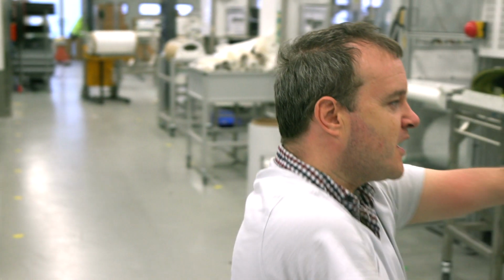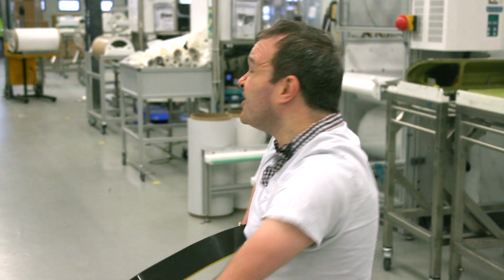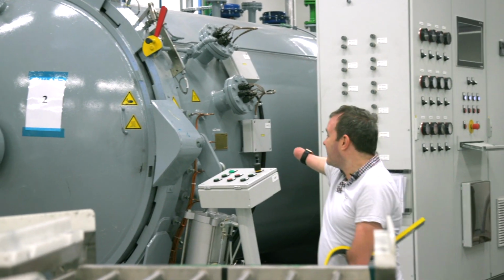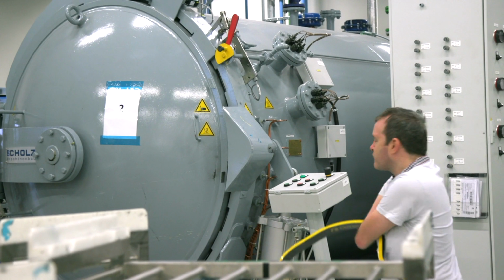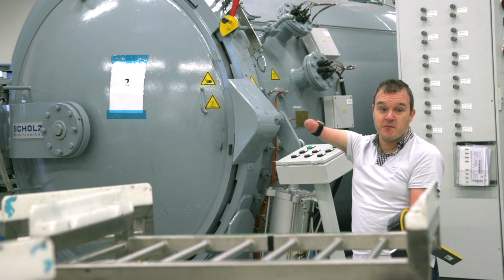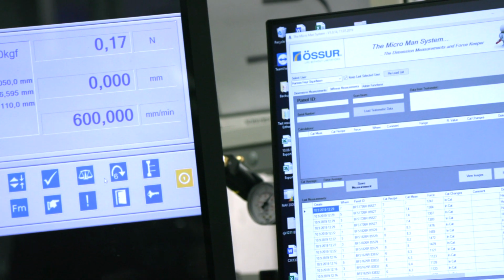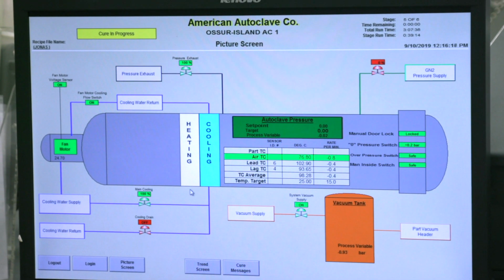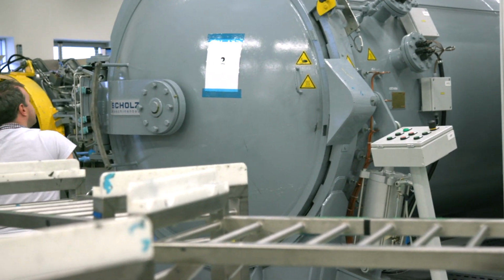You've got the start of the process here, then you've got some moulds on the left which we're not allowed to show you. Now this is essentially a giant oven, and once they're laminated and pressed together and covered in the resin, they go into one of these which applies temperature but also pressure, which is really important because that's what condenses these and gives them their solidity. I wouldn't much fancy getting inside one of these things. Probably end up with a bend.